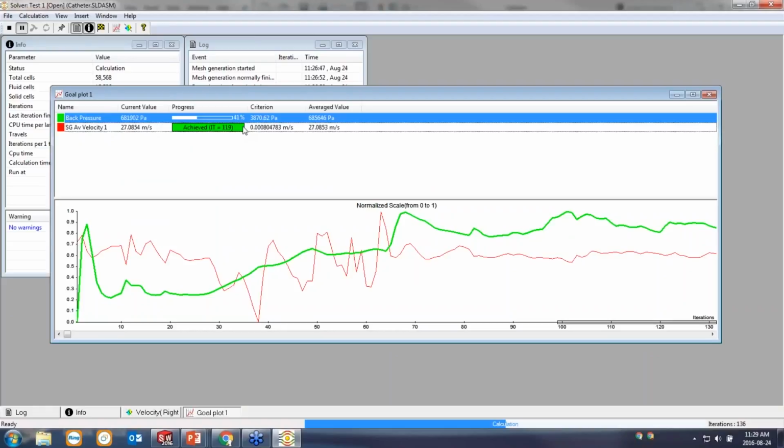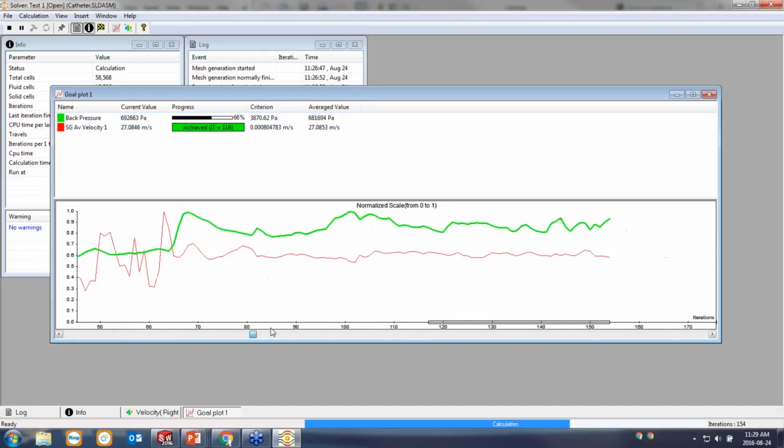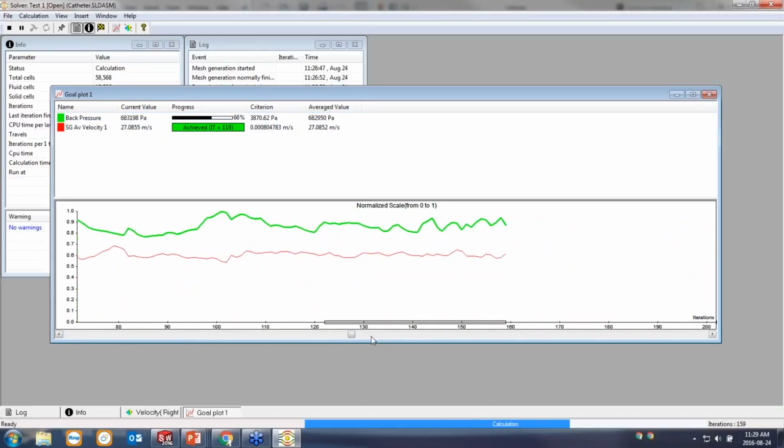And that makes sense, right? It's really just a geometry problem at this point. But my back pressure, that still hasn't converged. It's still fluctuating. So we'll let this keep solving, and we'll see that back pressure approach a particular value. And we can see how that's done over the iterations of this solution.